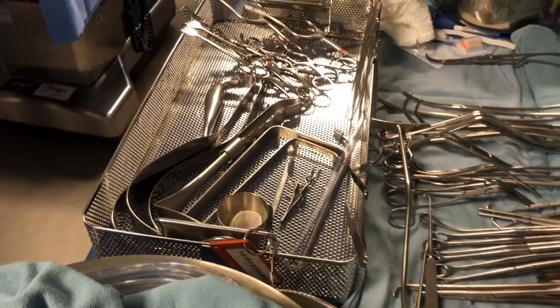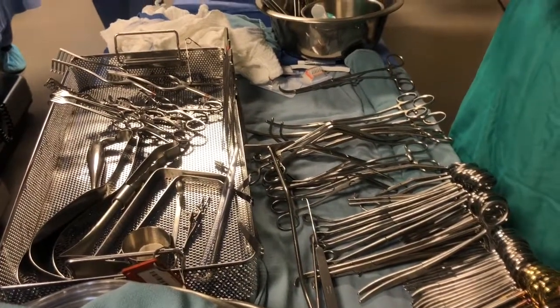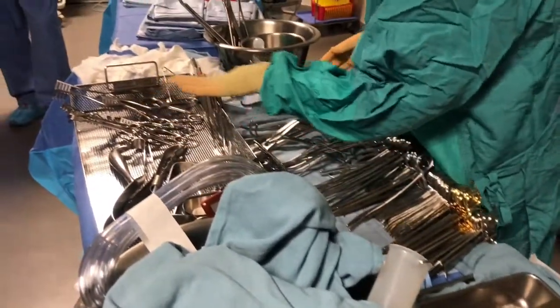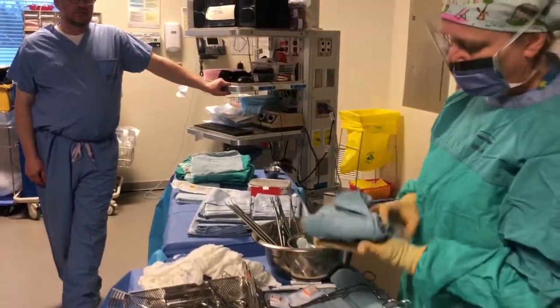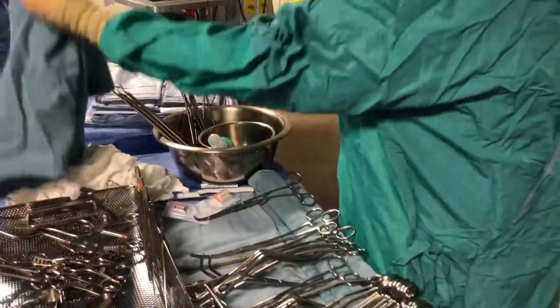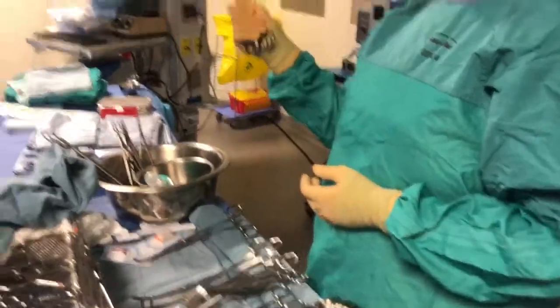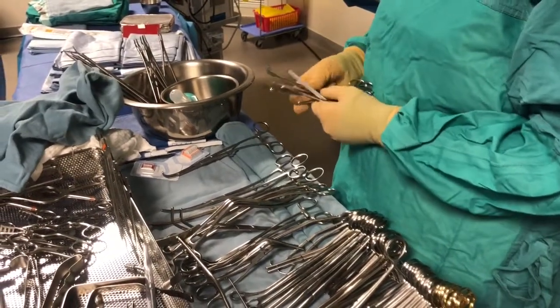Okay? So that's how we would do a count. And then what I do, usually we have communication between us, and I would take my hand and go through here and look, make sure that I've picked up and got everything on my table. So I'm going to say to you, I missed some instruments. Basically, I won't even set it on my table because I've found these instruments. So I want you to add to the count.